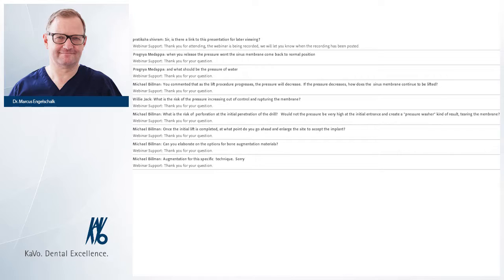It's a question of cost, and you need a second entrance for the endoscope because you have to look from the top to the left. So you're creating a second wound for the patient. The direct view, the movement of the membrane, needs a direct view, so it's nothing for the internal sinus floor elevation. Feasibility and soft tissue means the intraoperative X-ray doesn't show you soft tissue at all. And the monitoring, if you see something on a computer, on a display, this will be minimal invasive.